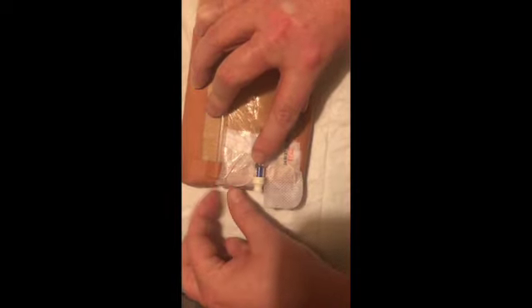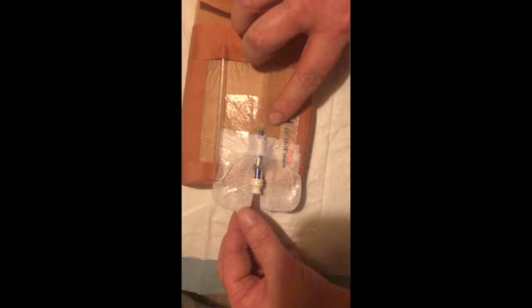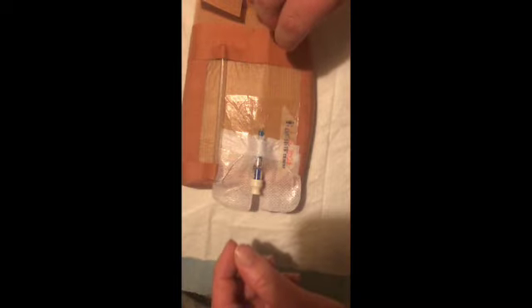and ideally I'd be wearing gloves. It's important to anchor the bung and to start picking up the dressing from the edges. Now whenever you're pulling on the dressing, you want to be moving towards the incision site here, and that'll avoid any tugging and dislodging of the cannula where you can.